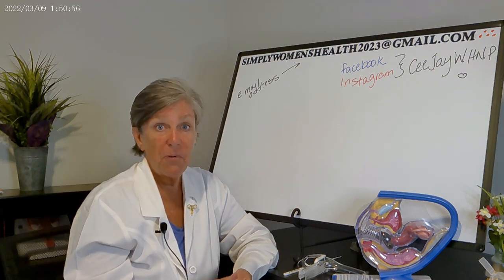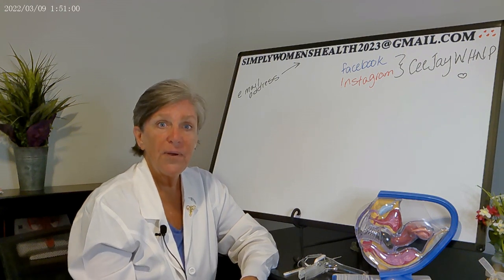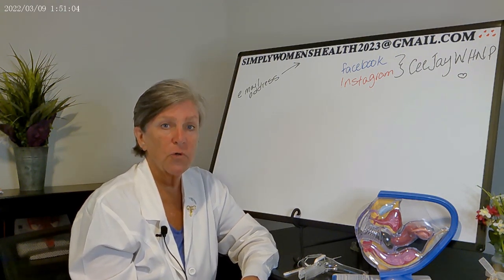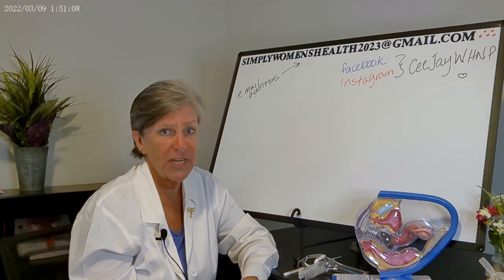This device is 99.8% effective for pregnancy prevention. Notice I did not say 100. The only way that I can promise you that you will not get pregnant is if you don't have sex or you become a lesbian. Otherwise, if the penis and the vagina are in the same room, there is always a chance.